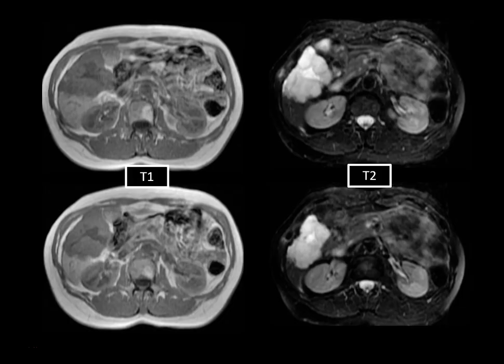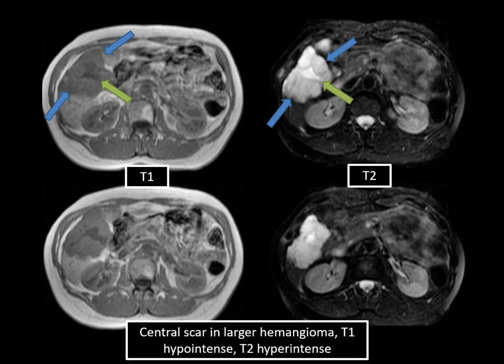The third enhancement pattern on MRI involves a large hemangioma with a central scar. On T1 and T2-weighted images, the central scar is T1 dark and T2 bright relative to the remaining hemangioma. The central scar in these larger hemangiomas should be T1 dark and T2 bright, while the surrounding aspect of the hemangioma remains homogeneous — particularly on T2-weighted images.